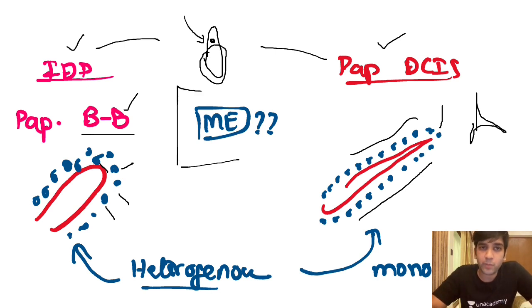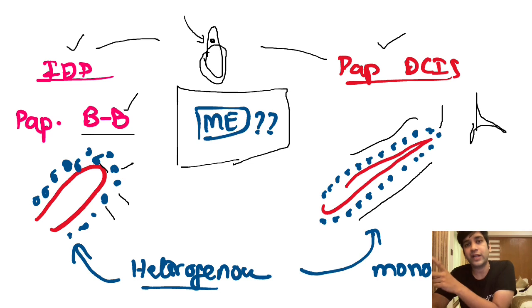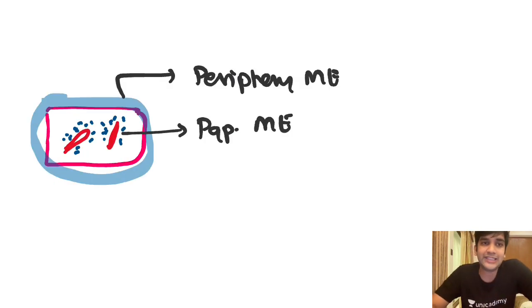That's with the epithelial component. So when I take my myoepithelial component, when you apply IHC as well as when you look at the histomorphology, I want you to look at the myoepithelial component in two different aspects. That's very important. I'll tell you both aspects, and that will easily help us to understand IHC, right? This is the thing.